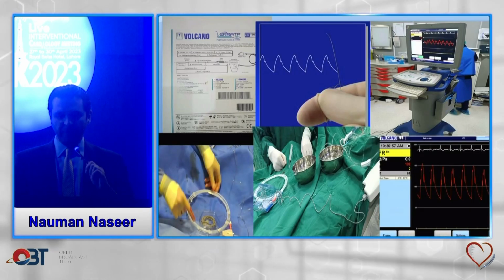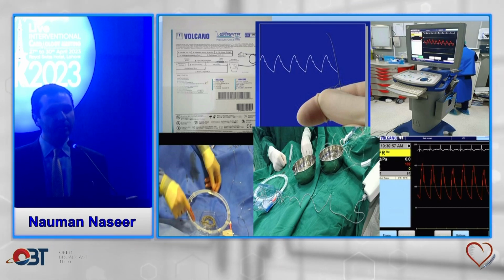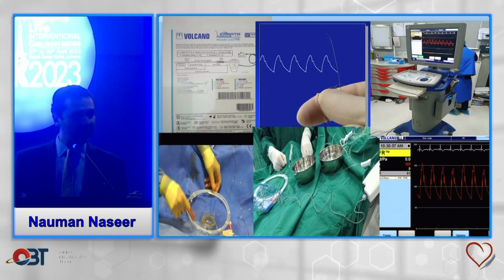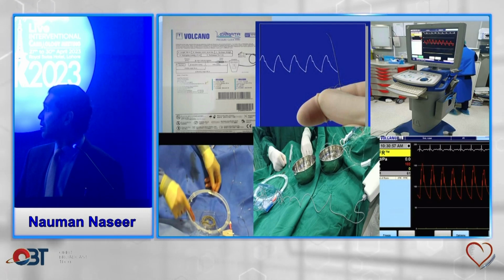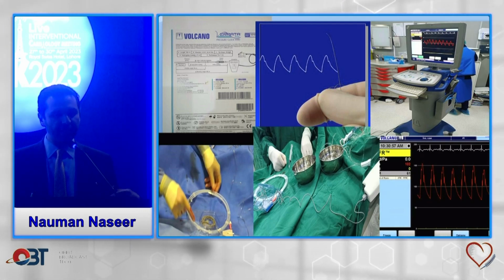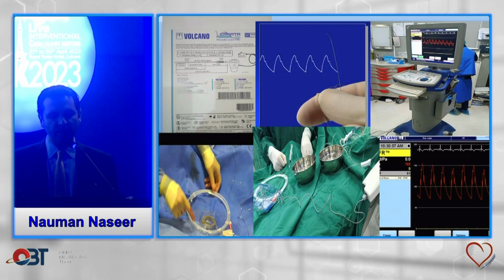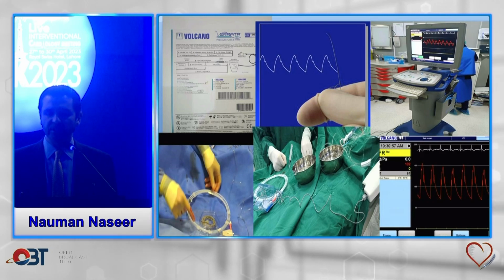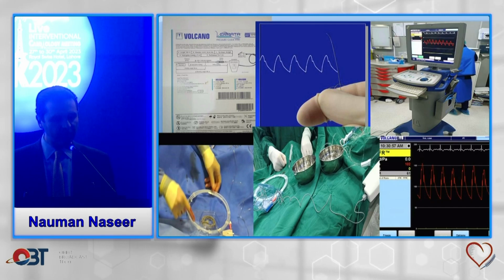So now this is just pictures taken by the phone from our tech who shared with me in the cath lab. So we use a Volcano system. We use the Volcano system, and you can see the 0.014 wire, which is a regular wire. It's just not as steerable as the regular wires. And you can see the console of the Volcano system, which is a pressure wire and IVUS over there.